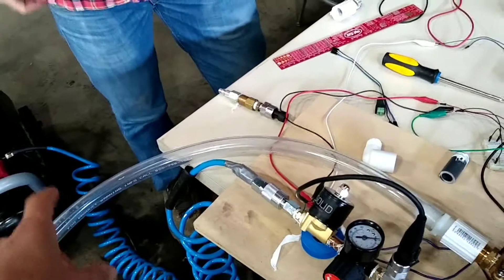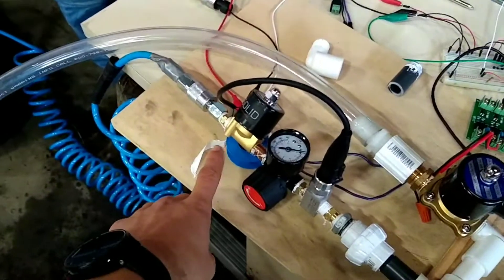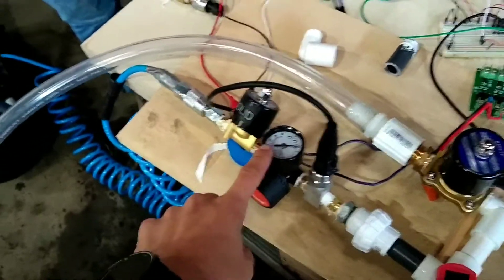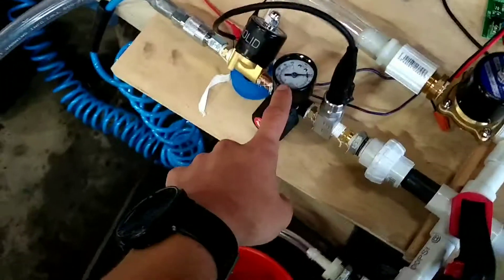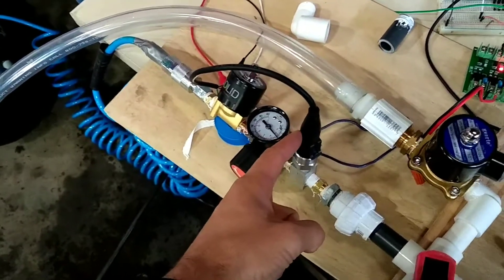We don't have the upstream oxygen mixing or air filtration we would need. Going into the first quarter-inch solenoid, we also don't have the oxygen-compliant solenoid we would want. Then we have the regulator — this is a cheap high-pressure regulator — and a cheap high-pressure 100 psi pressure sensor for motive.